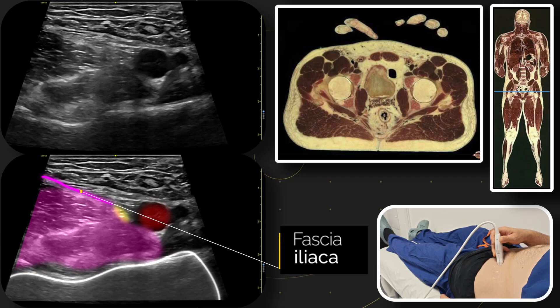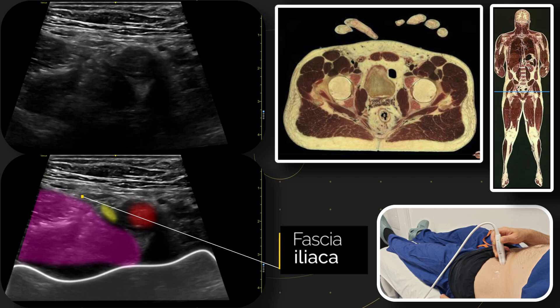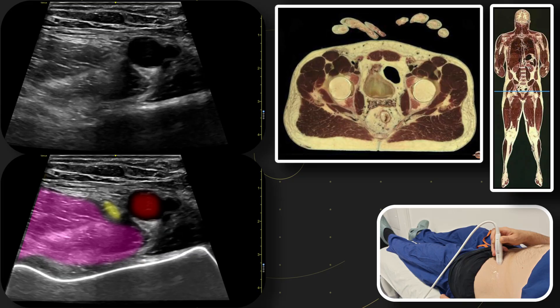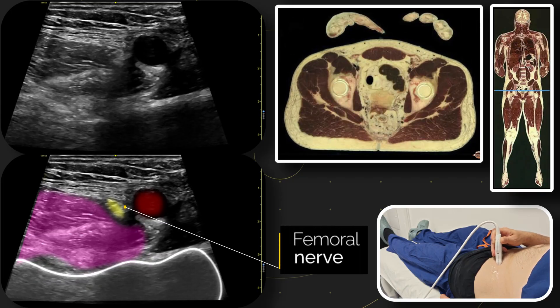We're going to follow that fascia iliaca medially towards the artery and look for the nerve. A common mistake is to think that this triangular fat pattern is the nerve. As you see, if we tilt the probe looking for that anisotropy, we can see that the nerve is this small structure here.